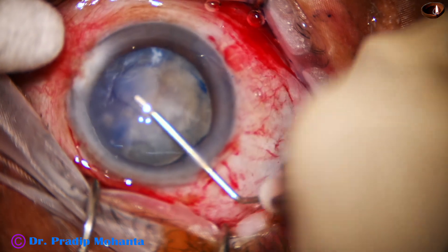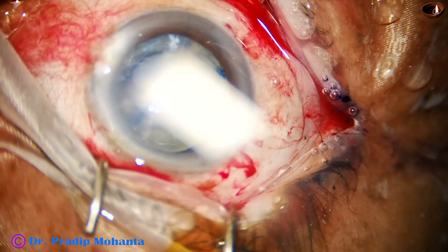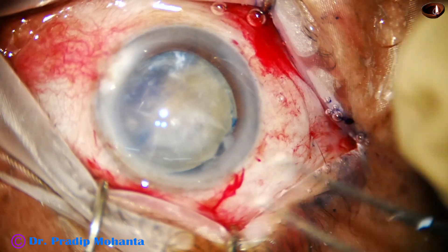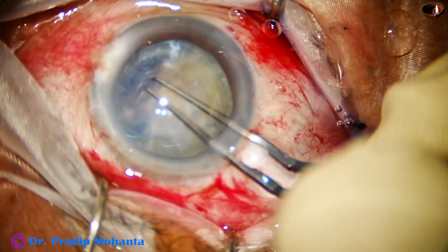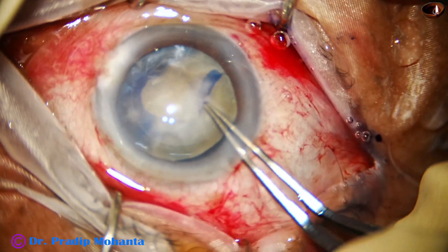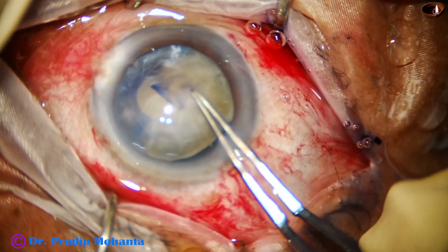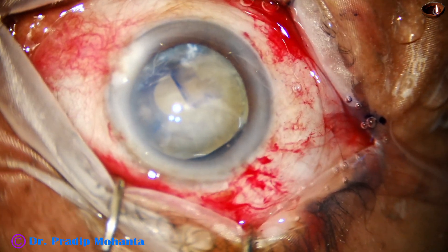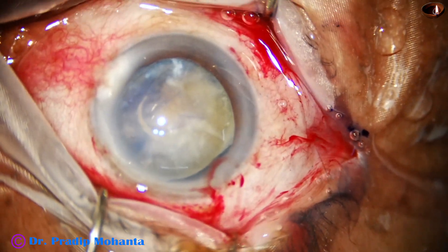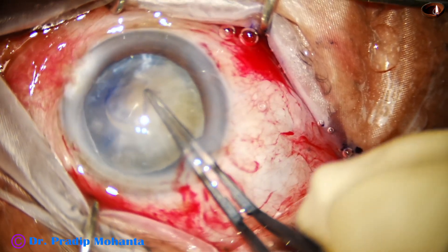I cannot pierce the capsule because there is zonular dehiscence with uveitis. I take a sharp needle and make an incision on the anterior capsule. Then I inject visco, hold the anterior capsule, and try to do a small rhexis. Small, because if I try to do a large rhexis and it runs out, I will have no other option than intracapsular cataract extraction. So here I did a small rhexis.